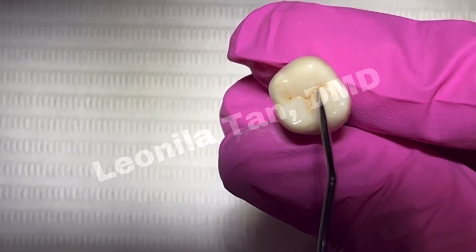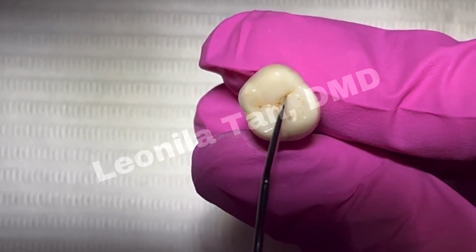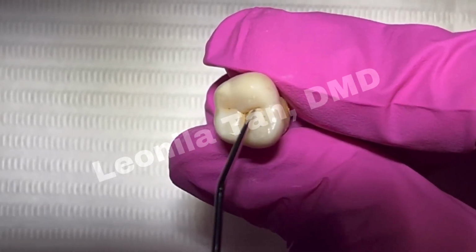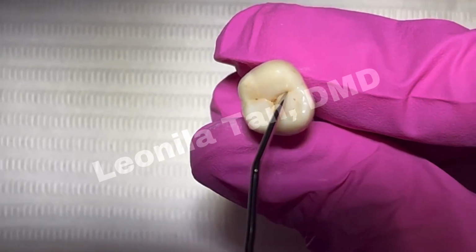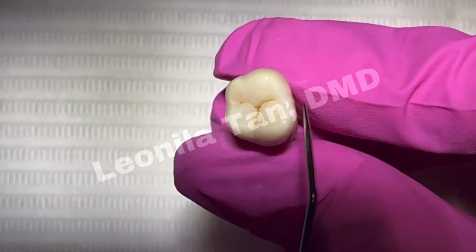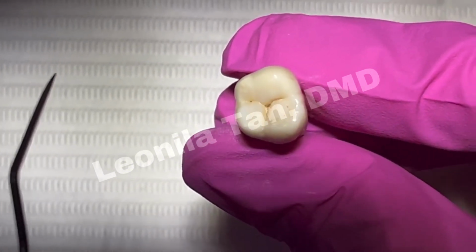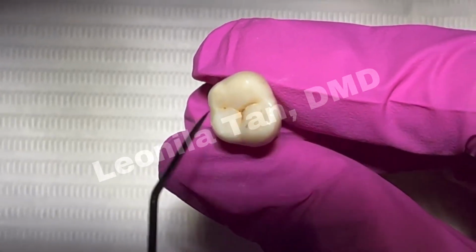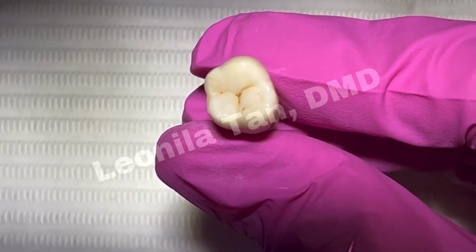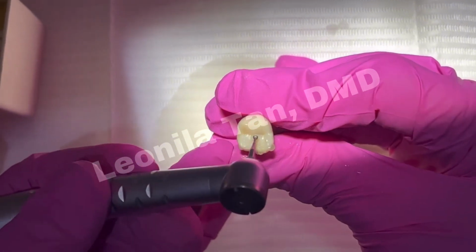So now we will start opening up for initial entry. The burrs you use for the molars would be the number 4 or the number 6, but you're always safe using the number 4 when you open on posterior teeth. You only use the number 6 if you see in your radiographs you have big chambers and you have a good space between the roof and the floor of your pulp chambers. So I am using a medium-sized burr or your number 4 burr.